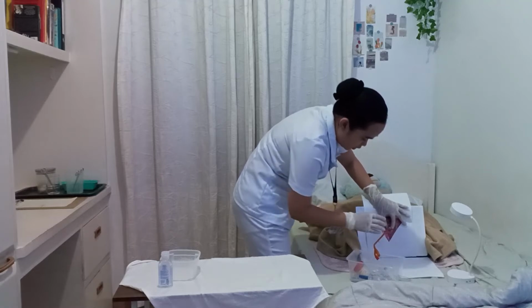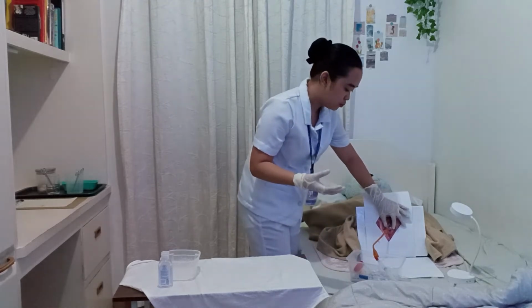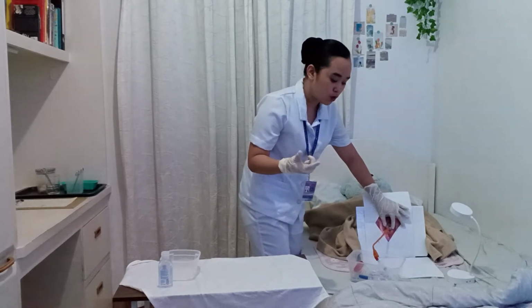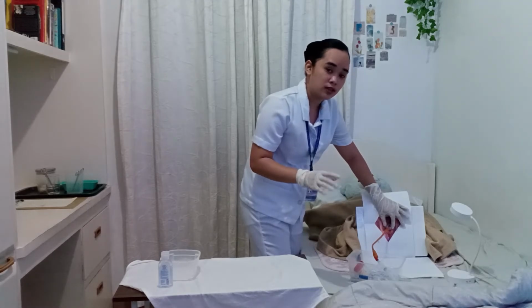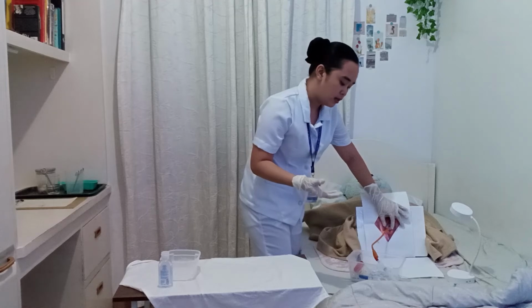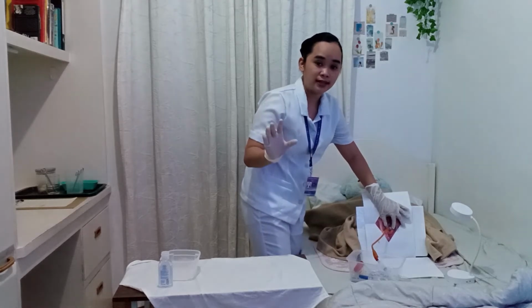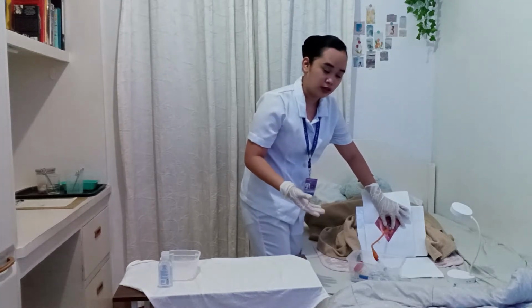So now, if a specimen is to be collected, we're going to pinch the catheter using our thumb and fingers, and we're going to place the specimen container on position. So this is done since the urine will flow out of the catheter if the lumen is not occluded. And I'm going to grab the specimen container using my dominant hand since this is sterile, and this will maintain the sterility of the container.